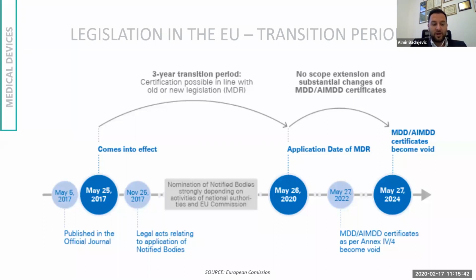And they are taking care very much about what you should perform when you change, and when your device is already on the market, for example, 1, 2, 3, 5, 10 years. To test the medical devices, there is also something very interesting. It said that all the conformity assessment and the testing of medical devices under the notified body will have to be performed by accredited laboratories.